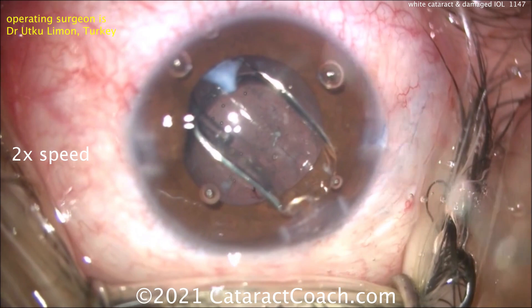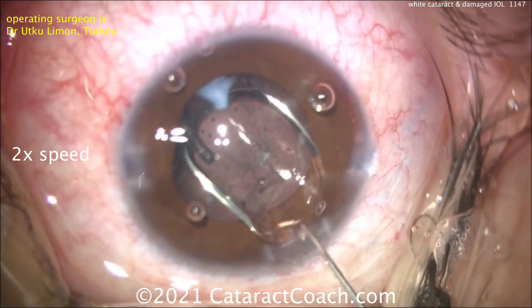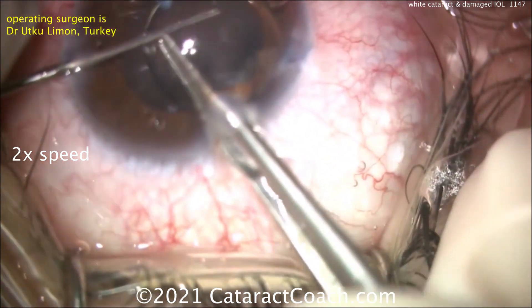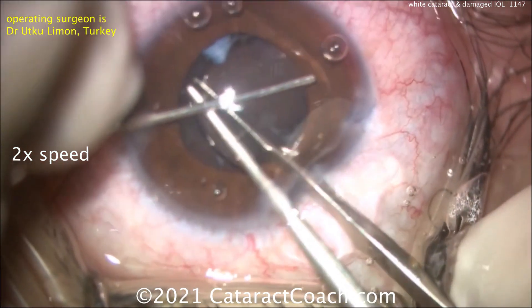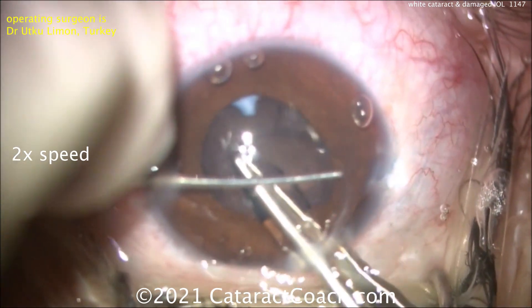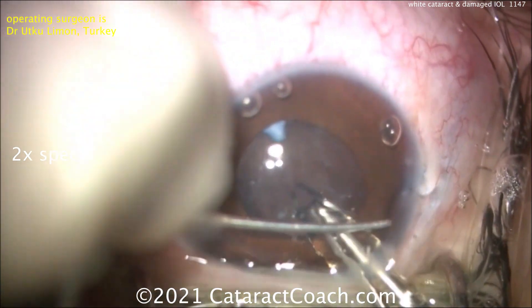Here comes the lens going inside the eye — and what do you notice? There's no trailing haptic. So you had a technician who didn't know the lens right. We're going to spin the lens over, and look at this — where have you seen that before? That's the twist-and-out technique that we like to talk about here on Cataract Coach, and that lens can be pulled right out of the eye.